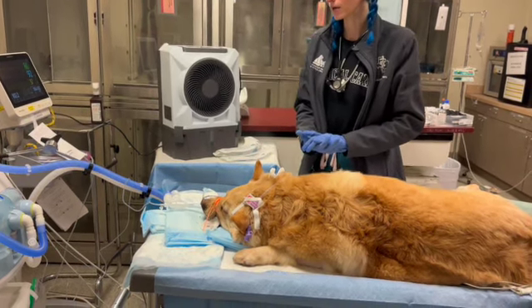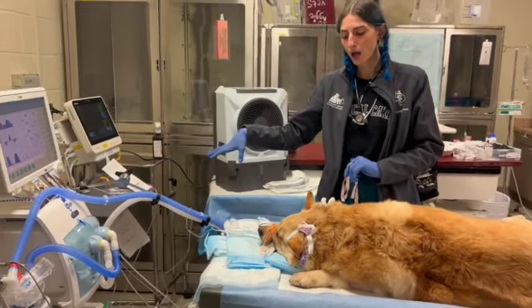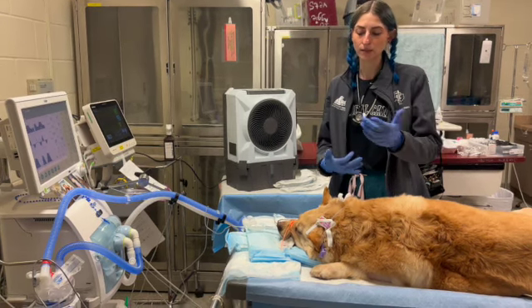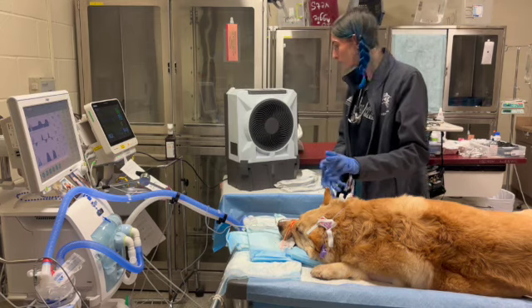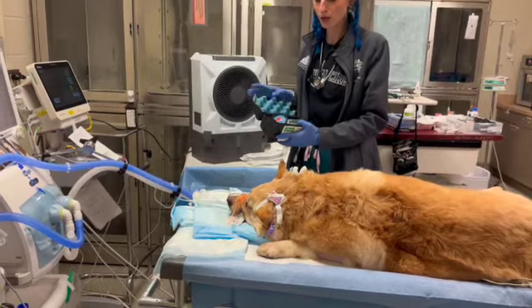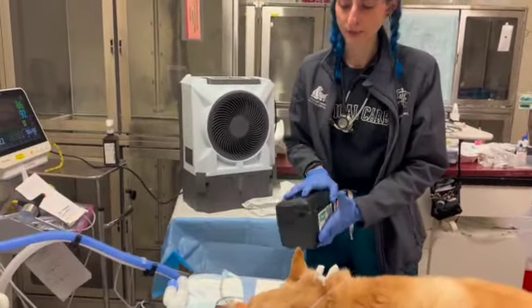Another indicator, if this patient wasn't on a ventilator and was on an anesthetic machine, you could have someone bag and hold and see if the machine has any leaks. And if there are no leaks, then that's a good indicator that there are no leaks in your tube. For our ventilated patients, we actually have an endotracheal tube inflator, so we can utilize that to measure the endotracheal tube and determine if it has leaks or not.